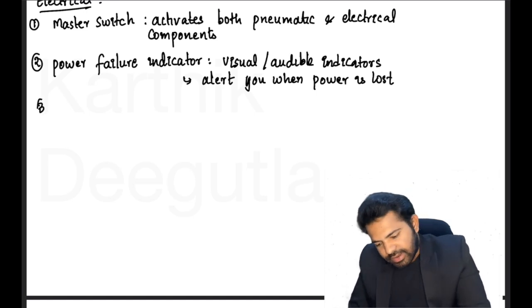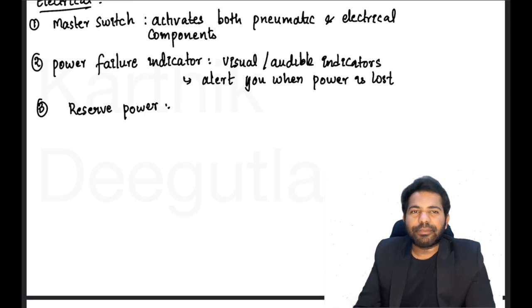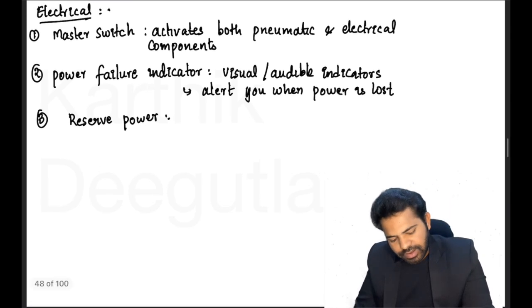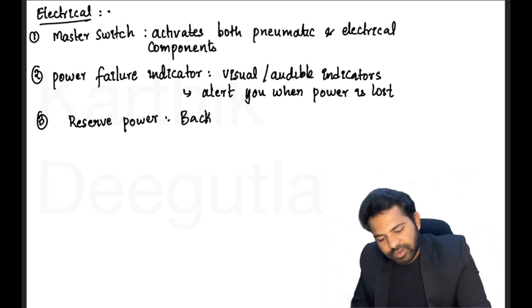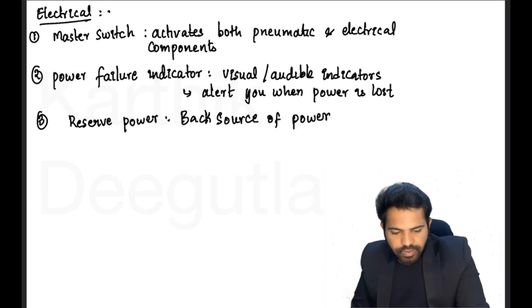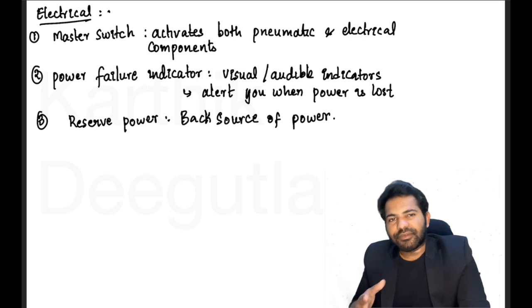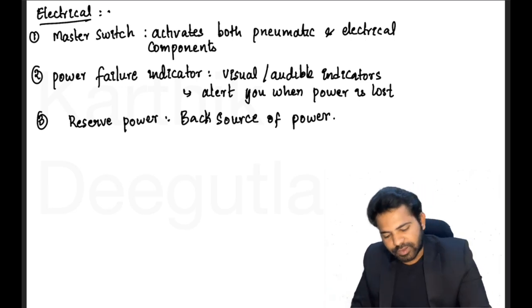Done. Now moving on, we have reserve power. Reserve power is nothing but a backup source of power. Whenever you are occasionally out of power, the reserve power will definitely be a good backup source.